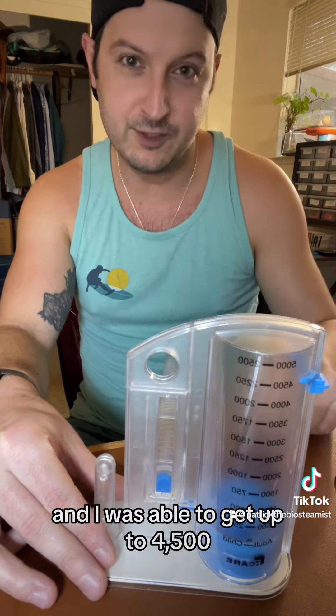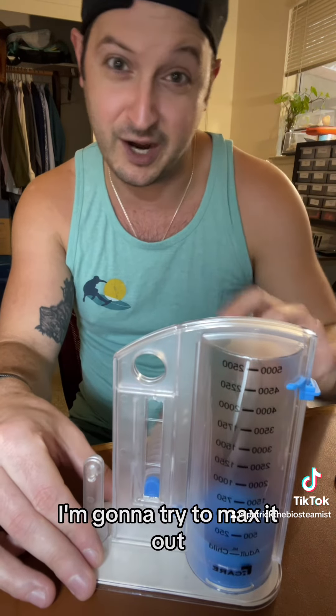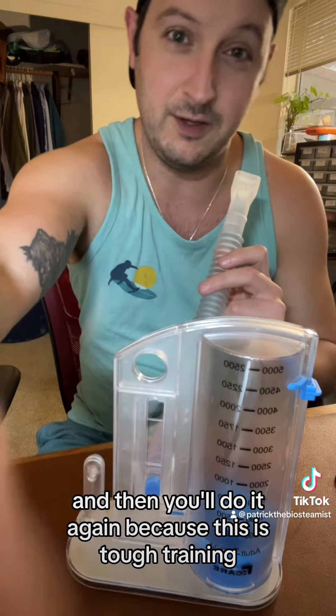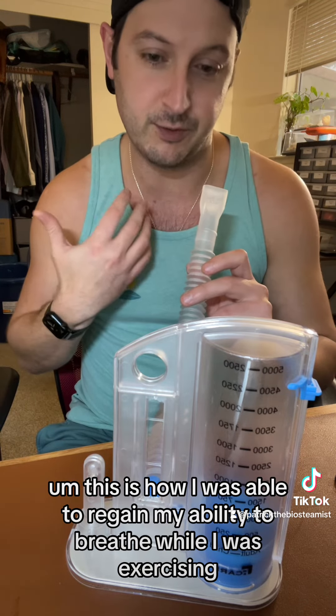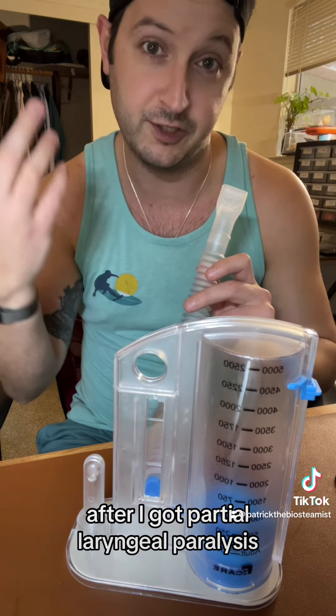I was able to get up to 4500 — that's what I marked there. I'm going to try to max it out, but that's how you're supposed to do this. Then you take a little pause and do it again, because this is tough training. This is how I was able to regain my ability to breathe while exercising after I got partial laryngeal paralysis.